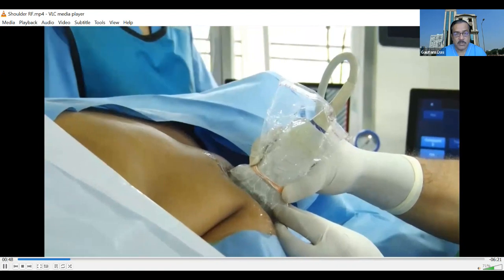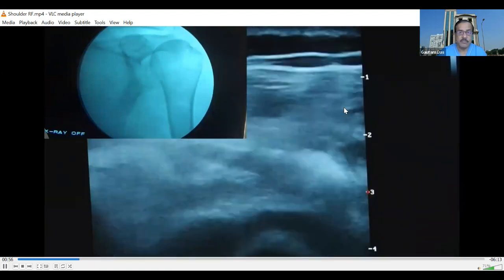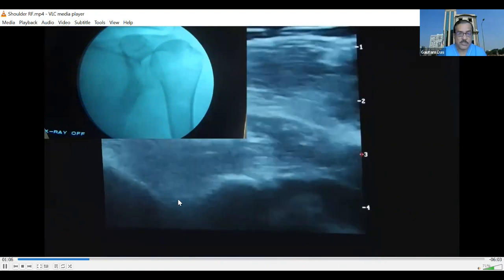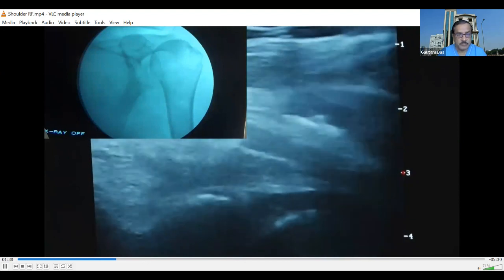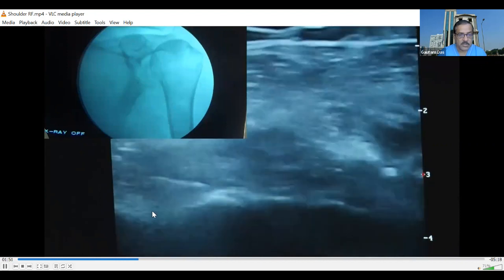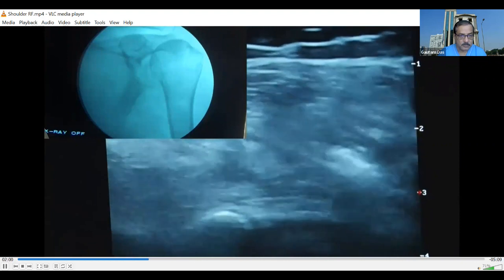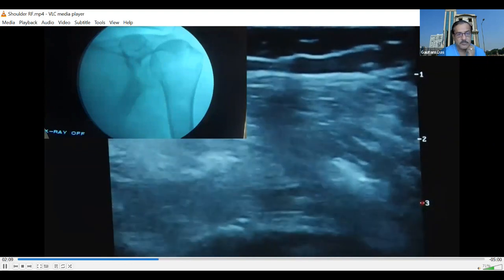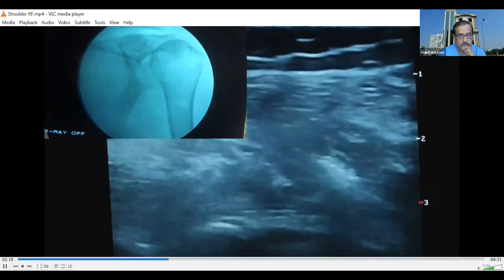After local infiltration, we start introducing the RF cannula. Initially the angle was not right — it was going too superficial — so we increased the angle to reach our target, the spinoglenoid notch. Pulsation is visible, and just beside that pulsation, the hyperechoic area represents the neural structures. We advance until we are close to and then at the target, touching the bone at the spinoglenoid notch.